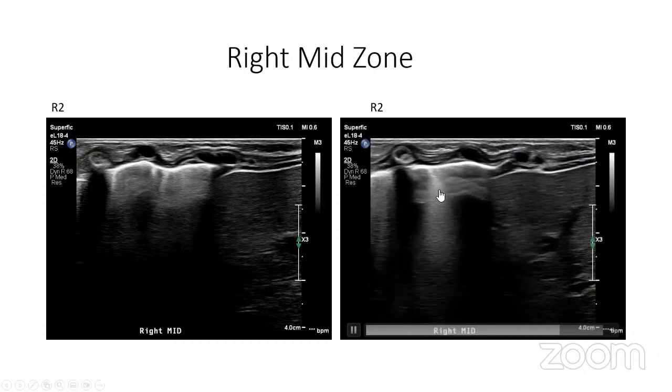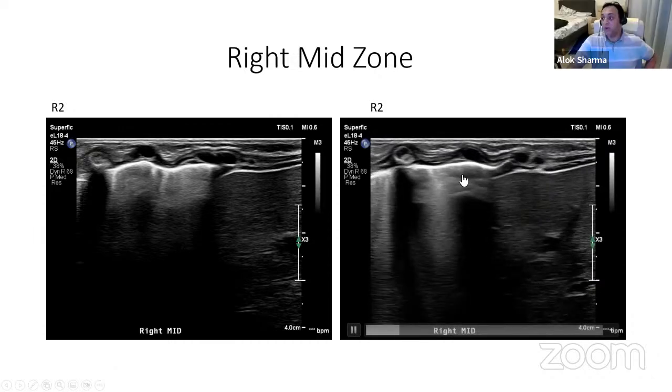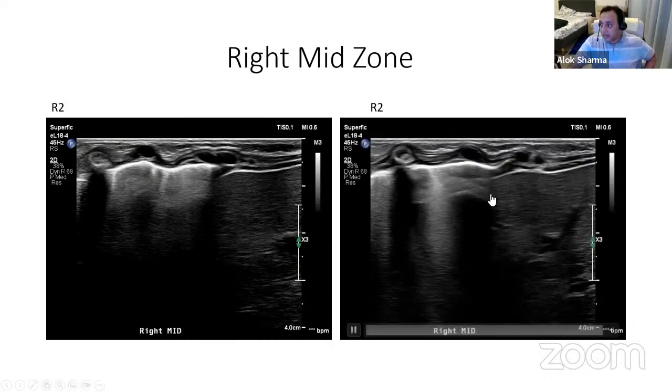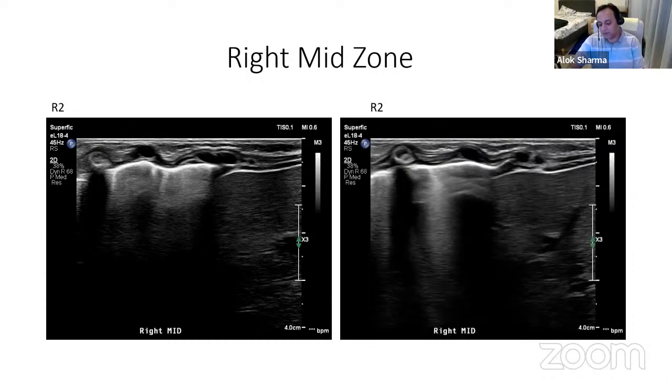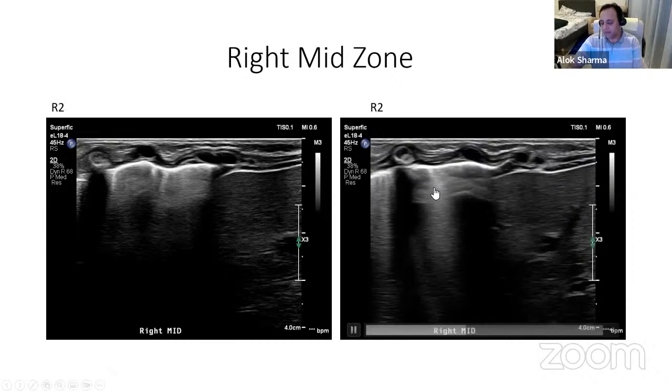So again, as you can see, this is what I would call a double lung point. And this is just a very good example, baby with meconium aspiration. So they can have double lung points as well. And this is just another example for you to say that a double lung point is not pathognomonic of TTN. And if anybody is telling you that, then they're not correct. I think that concept, Corsini's article that was published in 2012, has long been superseded. We see double lung points in a lot of other conditions.